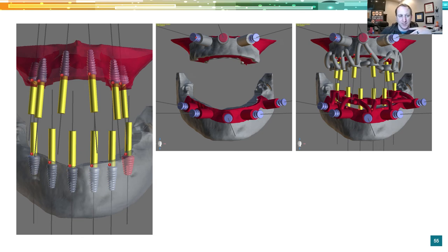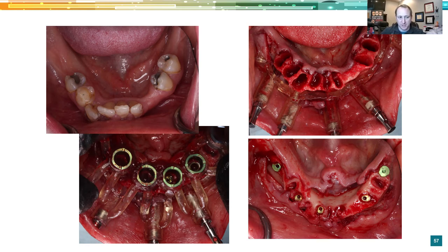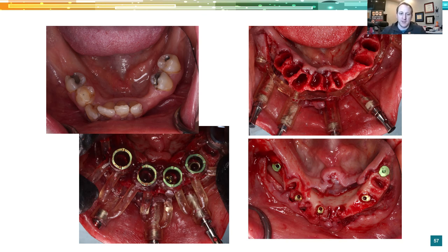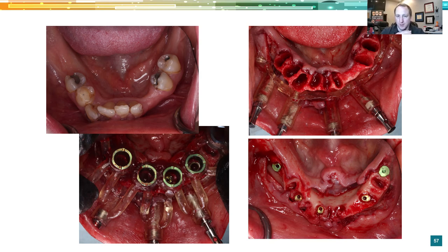The main requirement is a bone segmentation and a guide that fits intimately to the bone surface — not tooth-borne or soft tissue-borne. In this patient case planned for a fixed full-arch case, the patient's teeth are used to set the pins, the bone reduction is done with the guide in place, then that guide is removed and a new implant placement guide goes into the same pinholes. I designed and printed this myself using segmentation, Blue Sky Bio, and SprintRay — total cost out the door was about $40.